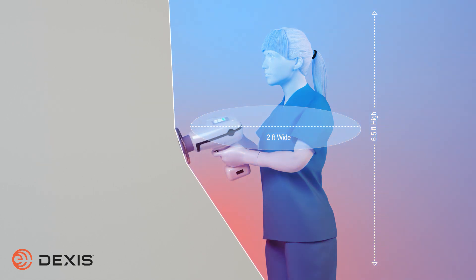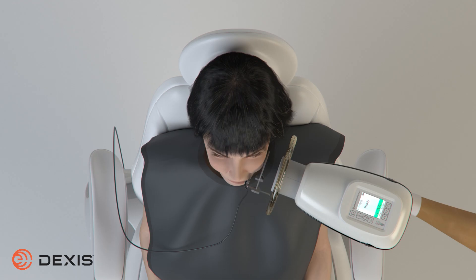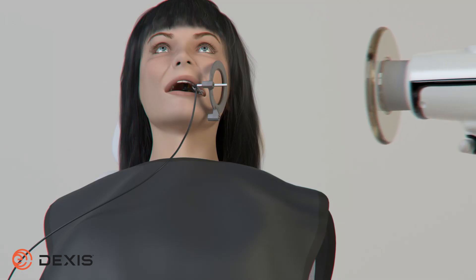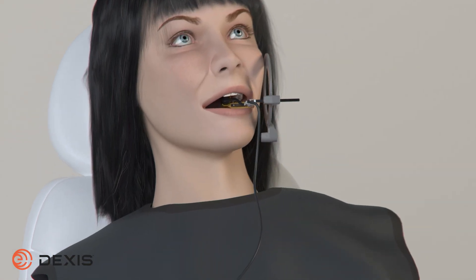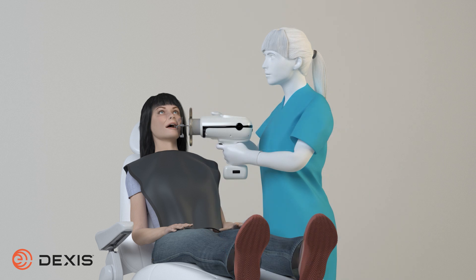When positioning, ensure the shield is all the way forward on the collimator and hold the unit as close to the patient as possible. When acquiring an image, if you need to angle the Nomad or adjust the backscatter shield and cannot remain completely within the protective zone, we recommend wearing a lead apron.